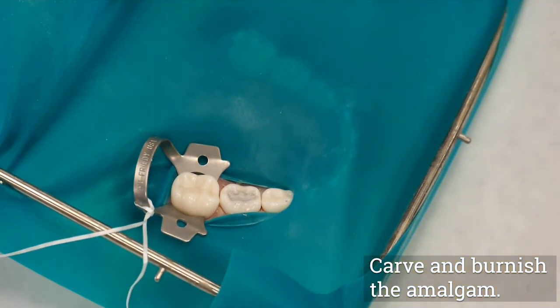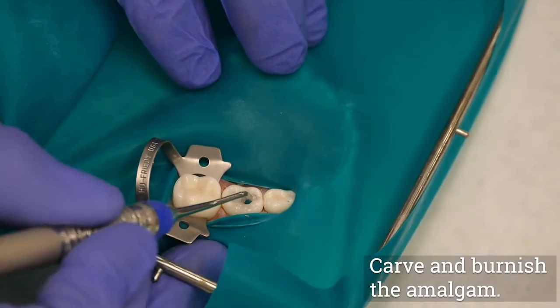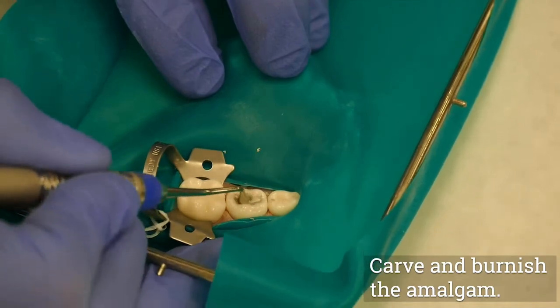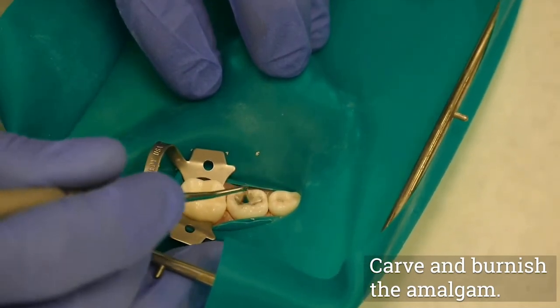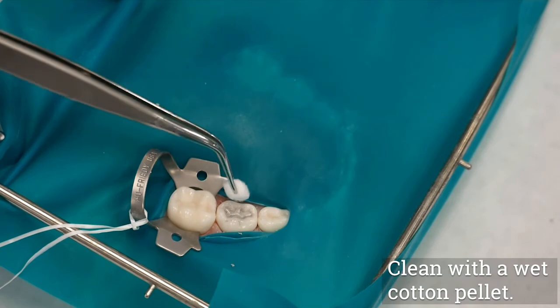When the amalgam has begun its initial set and resists deformation, begin to burnish the amalgam. This is done with a small round burnisher, which is lightly rubbed across the carved amalgam surface to produce a satin-like appearance. Besides smoothing, burnishing creates a substructure with fewer voids. A smooth finish can be obtained by using a wet cotton pellet.